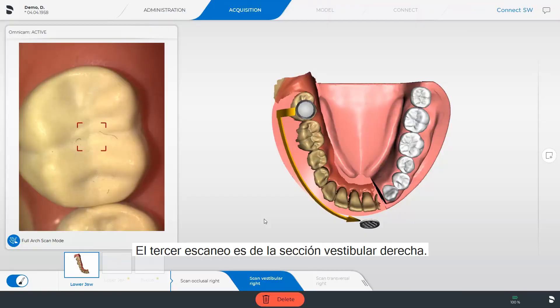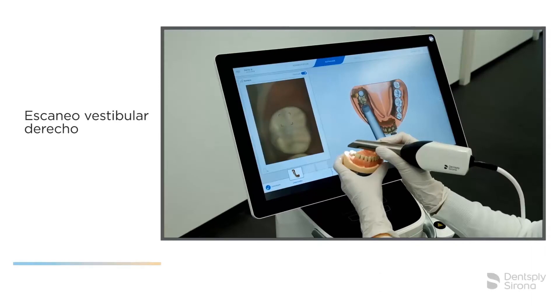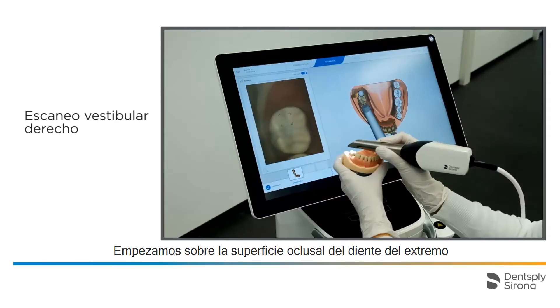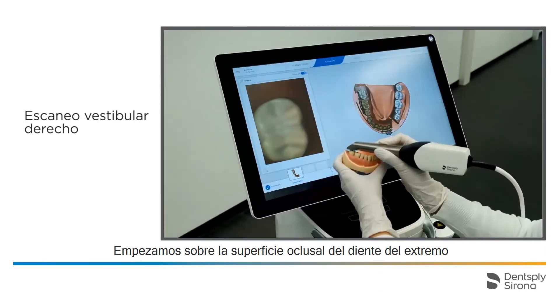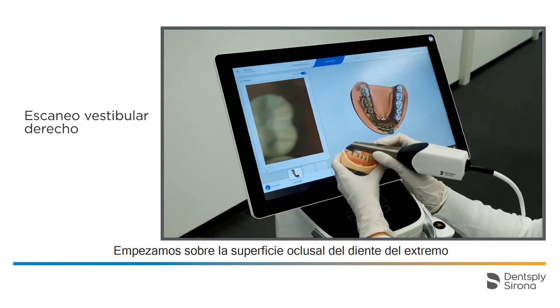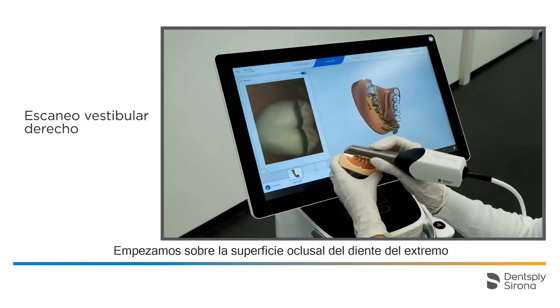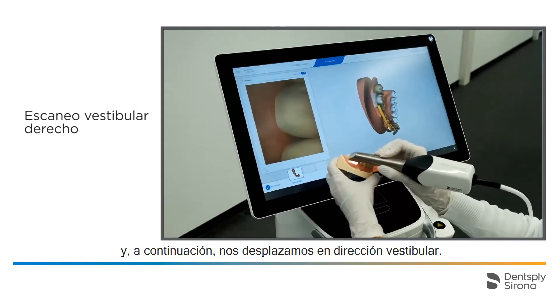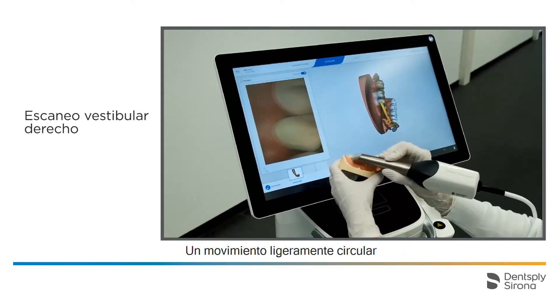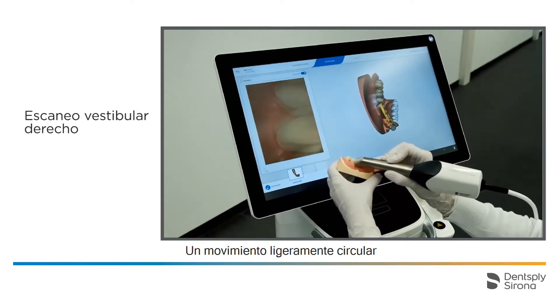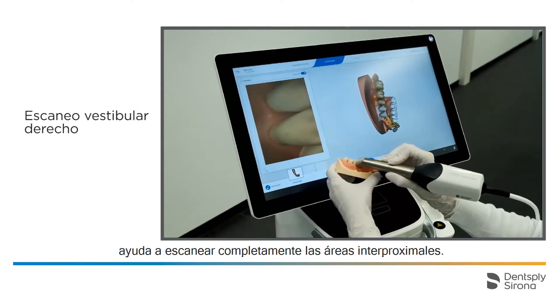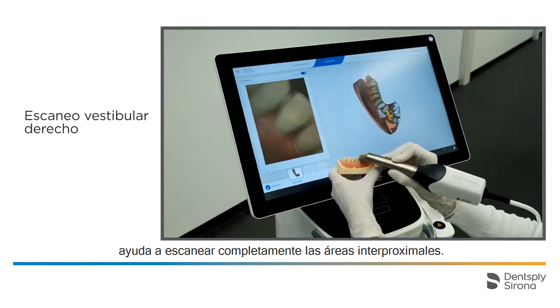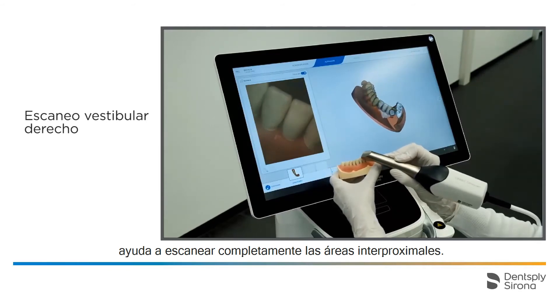During the third scan, we scan vestibular right. We begin on the occlusal surface of the end tooth and then move in vestibular direction. A slight wave-like motion helps fully scanning interproximal areas.